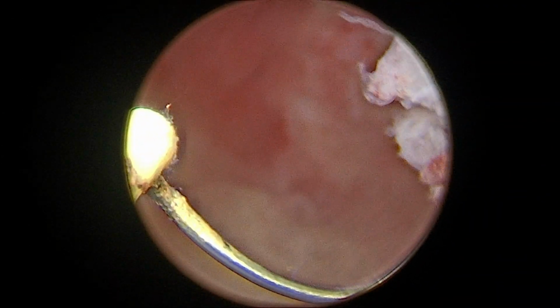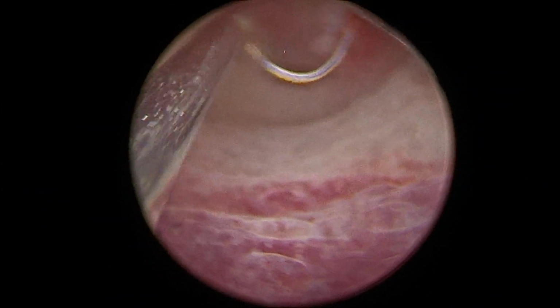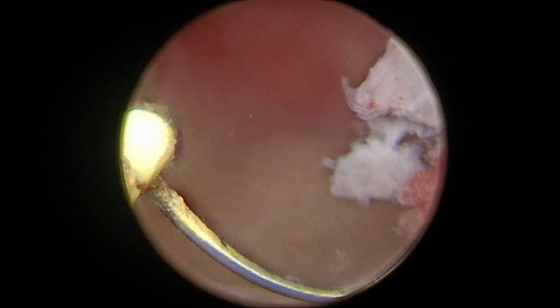So we can see this is only a small submucosal area, a small indentation of the mucosa on the right lateral wall, seen after reducing the intrauterine pressure from 140 to 80 centimeter of water. So now on hysteroscopic resectoscope, we can see a small indentation was seen only after reducing the uterine pressure. Otherwise, diagnostic hysteroscopy at 140 centimeter of water was not showing any intrauterine pathology.